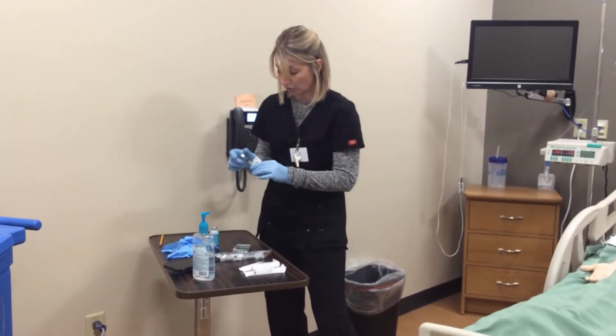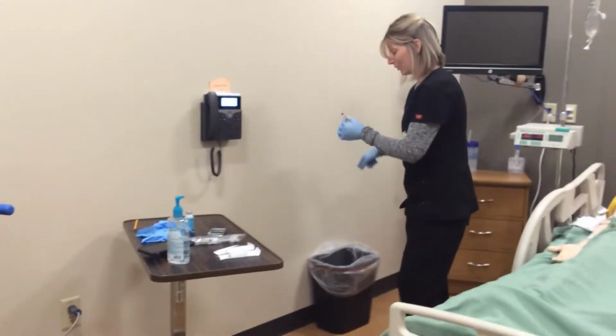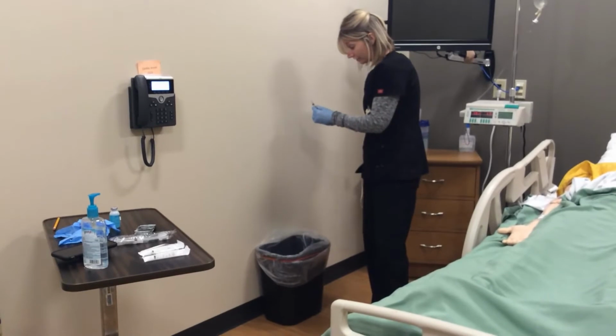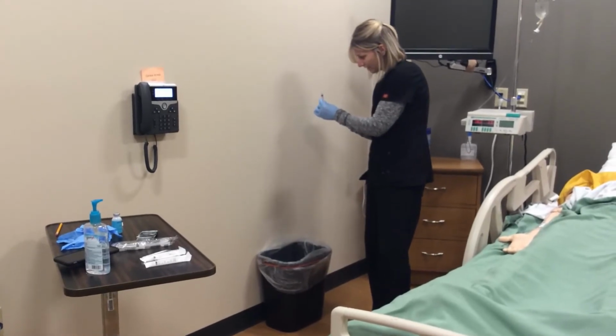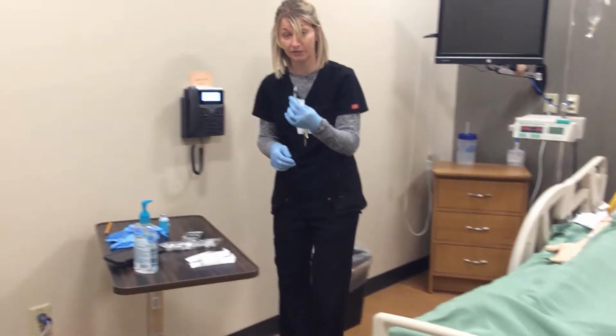Okay, so I'll go over the sink, and I apologize, the sink is over there and it's not a true functioning sink. So we're going to pretend this is a sink, and with my other RN verifying, I'm going to go ahead and waste it to where I have half an ml, which is my 2 milligrams, the order I'm supposed to give to my patient.